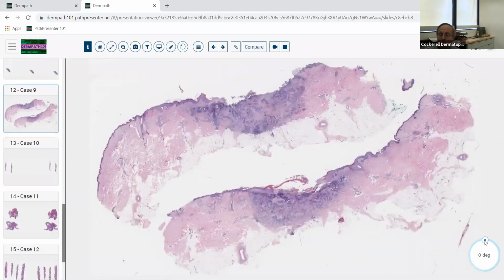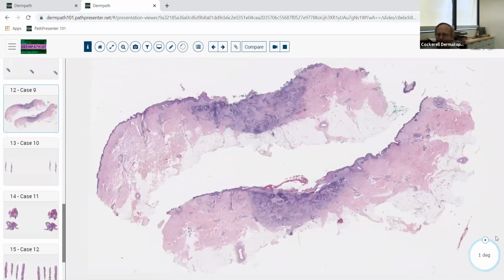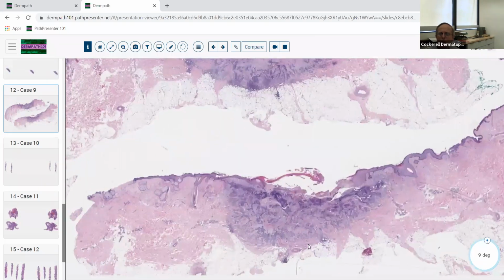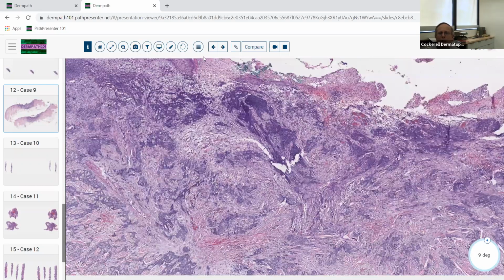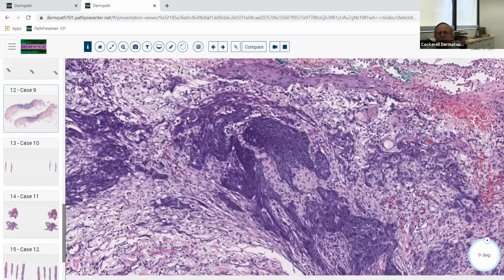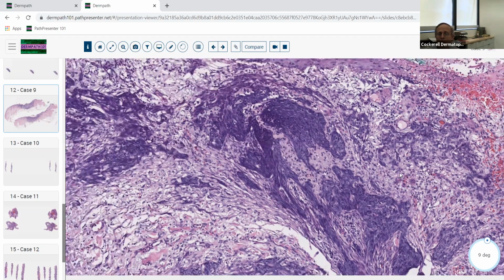And so now we've got an excision. And this one, again, a lot of dermatopathologists end up using the nodular diagnosis of basal cell carcinoma relatively generically. And if you had a superficial shave biopsy of something like this, and this is all we were presented with, this would probably be signed out as a nodular basal cell carcinoma. It is a nodule. It is a basal cell carcinoma, and we don't really know what's going on at the base if you just had a shave.